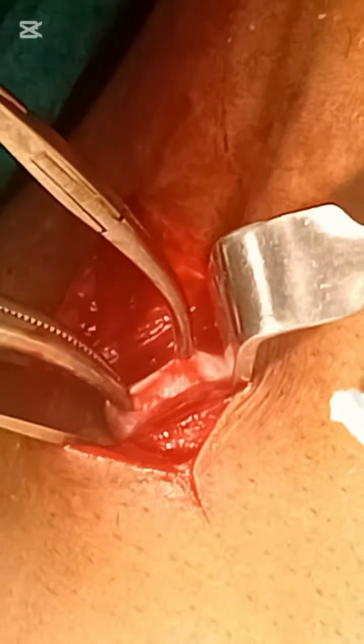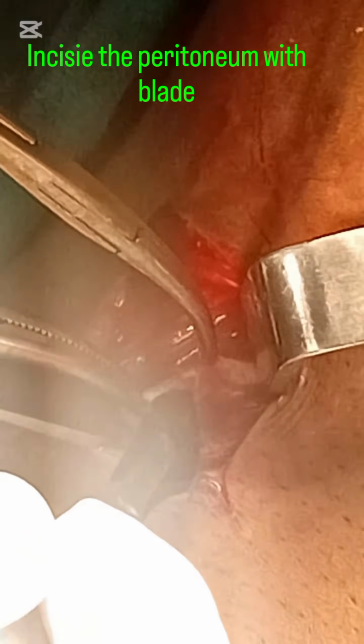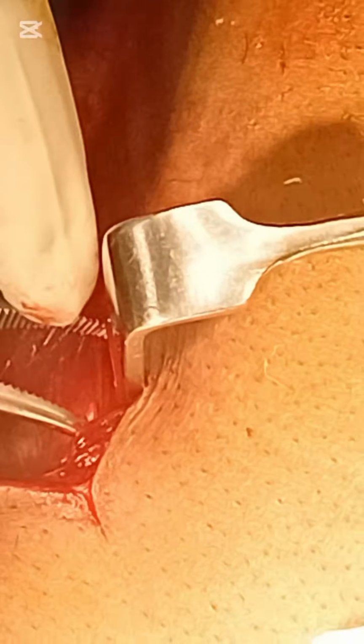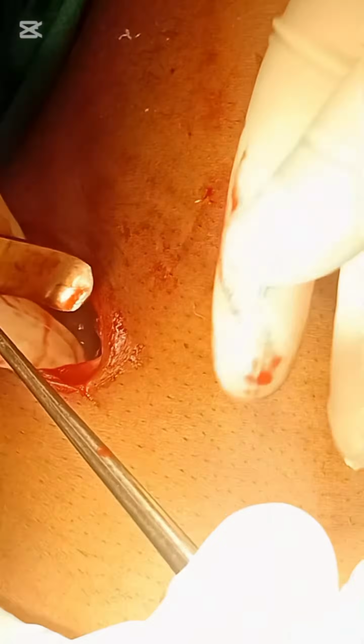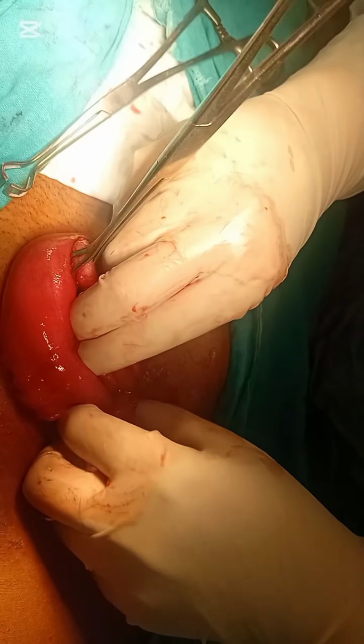Now make sure that you are in the peritoneum only by exposing the other end of the forceps. Now incise with a blade, just give a nick. Do not try to open it all, otherwise you will damage the gut lying below the peritoneum. Now pass artery forceps into the nick of the peritoneum or separate it bluntly with your finger. Swipe the finger all around in the abdominal cavity at 360 degrees and bring the appendix out.